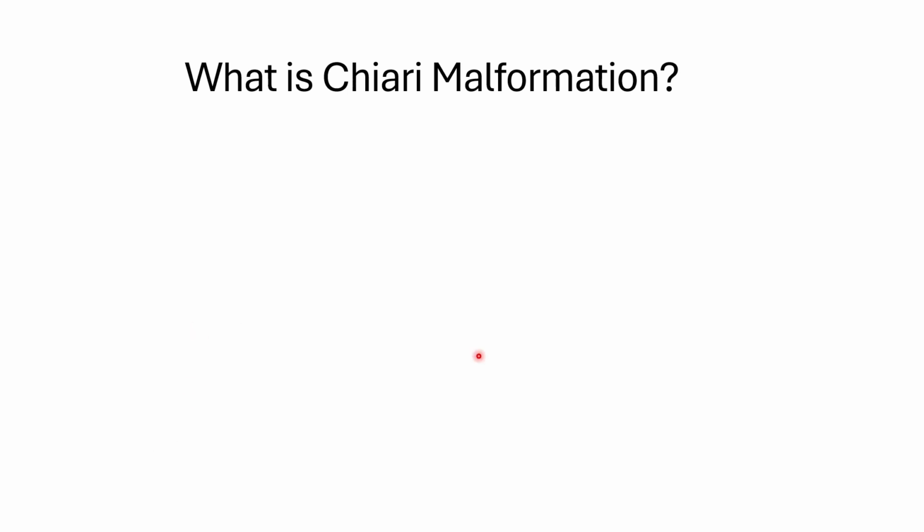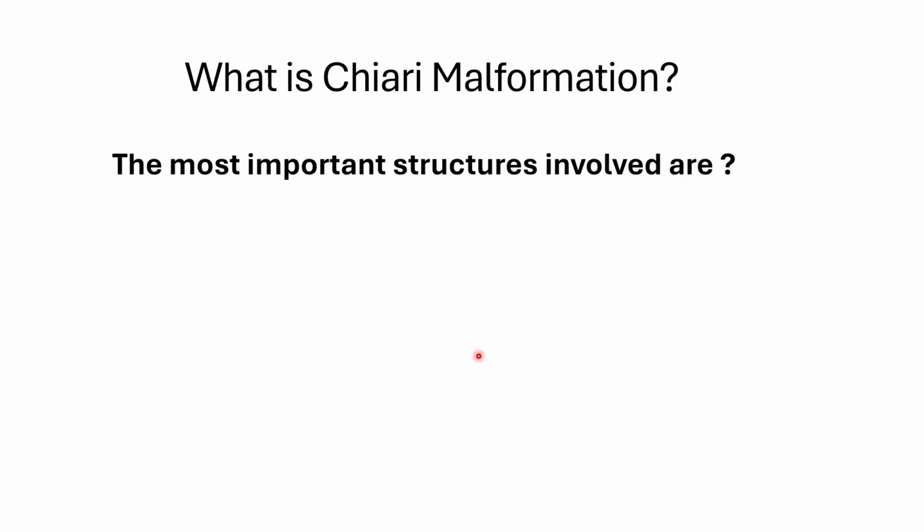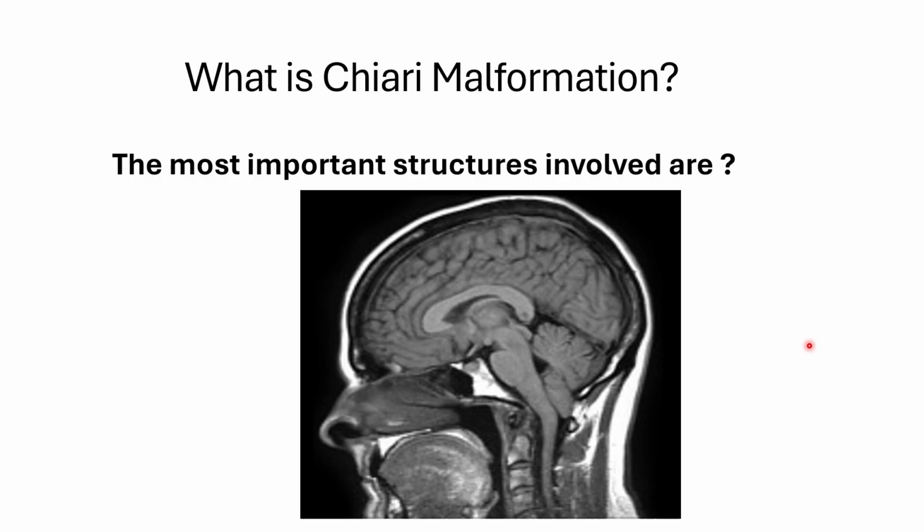Hello guys, in this video we will learn about the Chiari malformation. So what is Chiari malformation? And the most important structures involved in the Chiari malformations are.